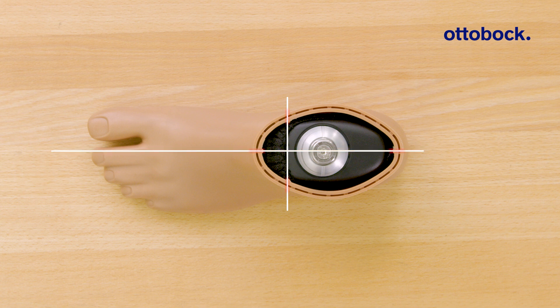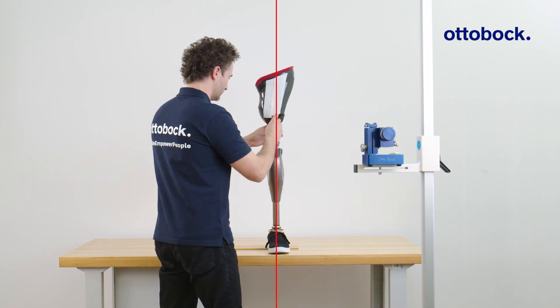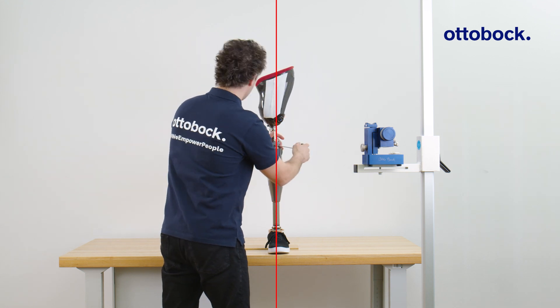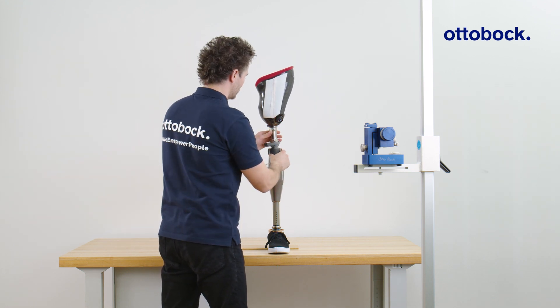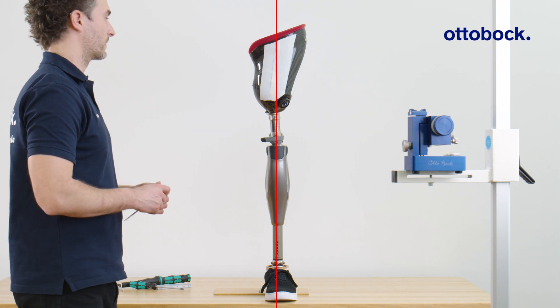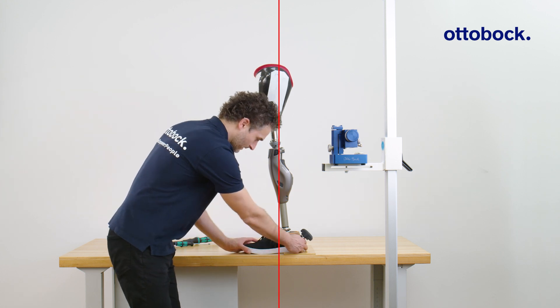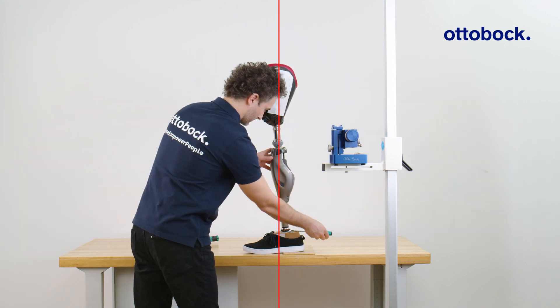If available, reference the markings on the foot shell. Refine the foot rotation with the user during dynamic alignment optimization. Pay attention to the position of the socket in both the frontal and sagittal plane, and observe the recommended socket flexion angle.